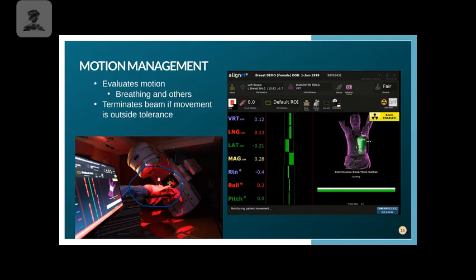And this is the screen that will show that. So it'll say, like, this patient we're treating somewhere on their left side. It could be a lung cancer patient or it could be a breast. It looks like left breast, actually. It's labeled up here. And with that left breast, we are concerned about the heart and the different areas that we are treating that are close to said breast.